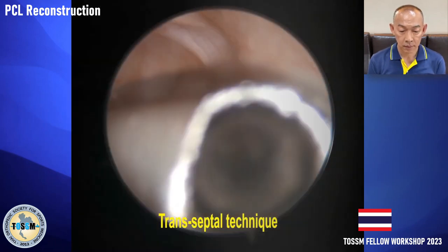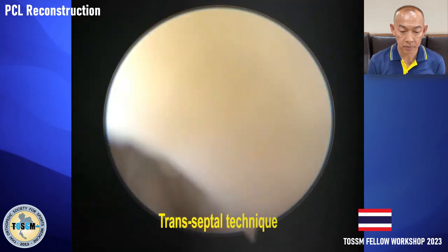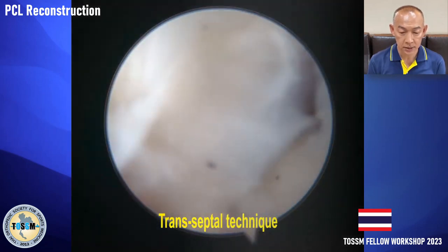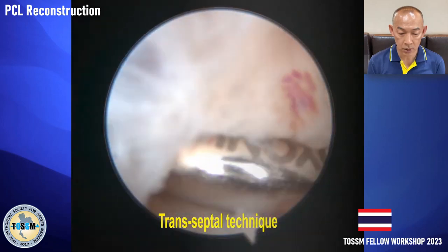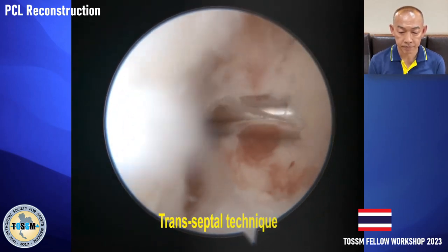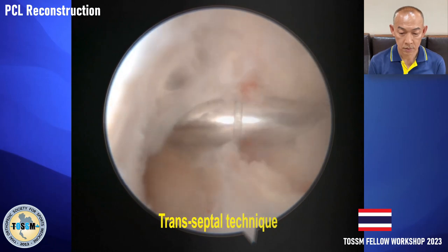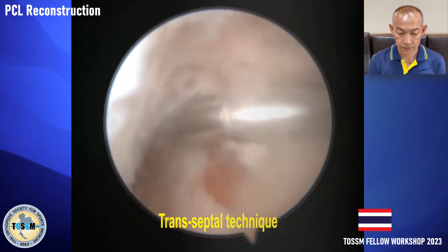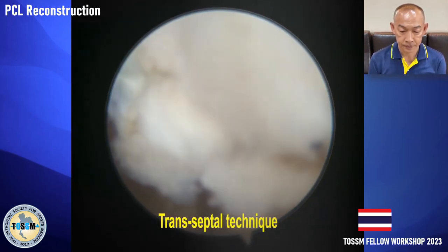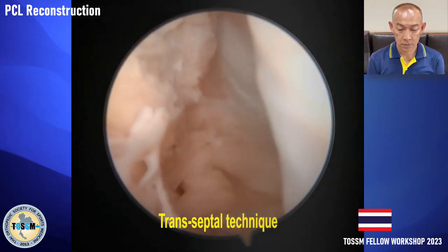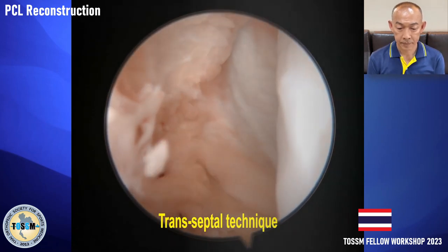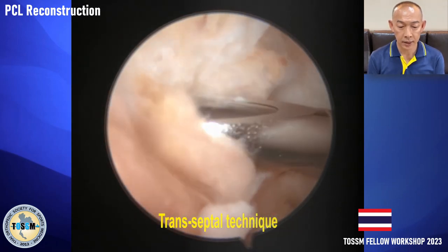The shaver was passed toward the posteromedial septum behind the ACL and advanced into the intercruciate space. Then the shaver was passed toward the posteromedial septum behind the PCL to divide the posteromedial septum, entering the posteromedial compartment. The shaver was then passed behind the PCL.